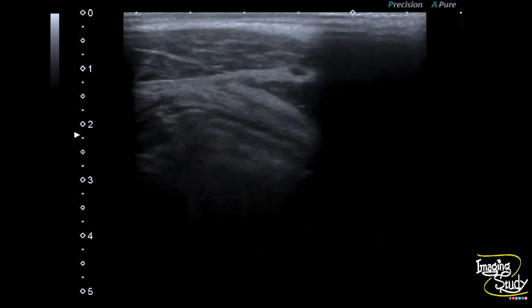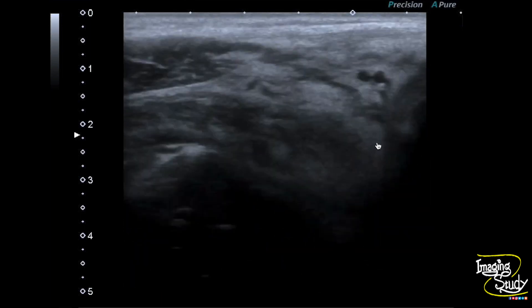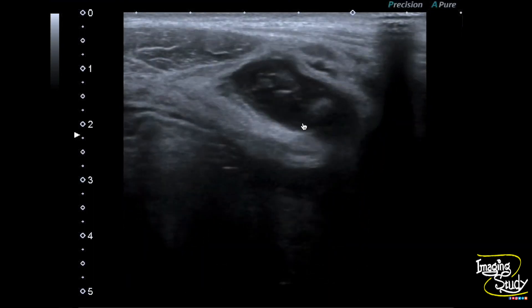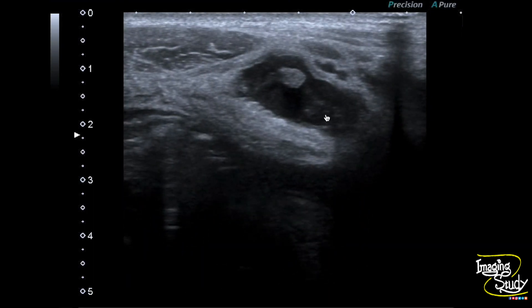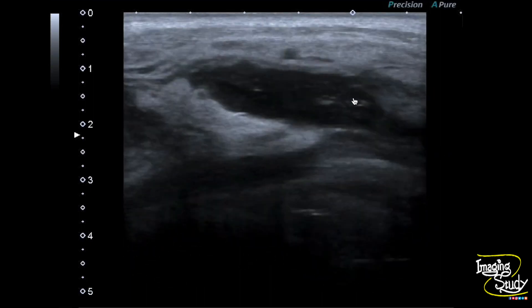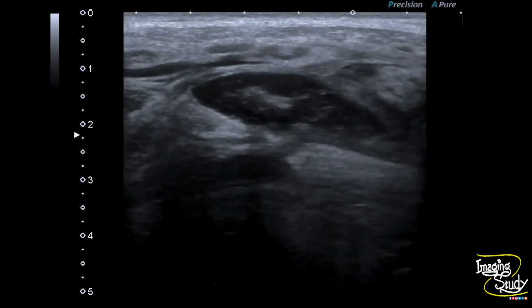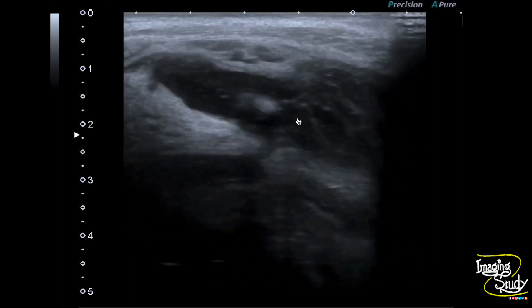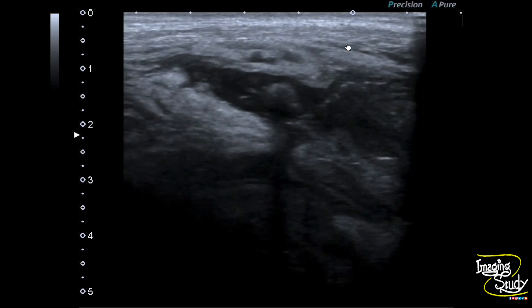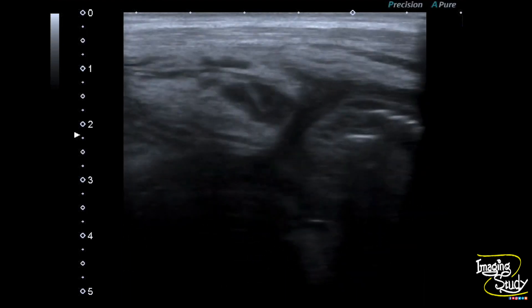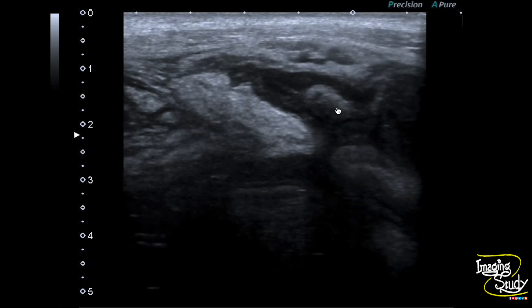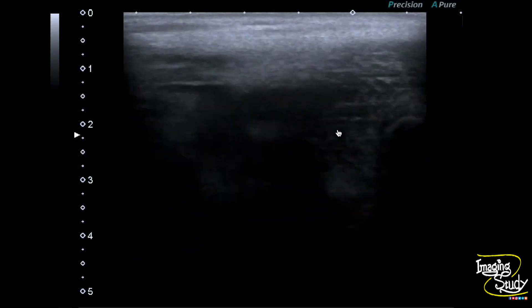Here you can see a blind-ended, distended, non-compressible tubular structure. It is of intestinal origin and it is connected to the adjacent cecum. You can see there is no gut signature at the wall. The surrounding fat appears hyperechoic and thickened, indicating fat stranding. There are at least two hyperechoic structures casting posterior acoustic shadows within the lumen, which are appendicoliths.